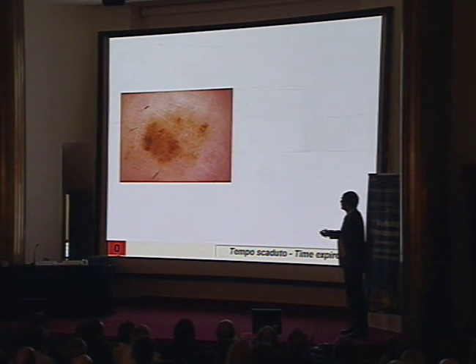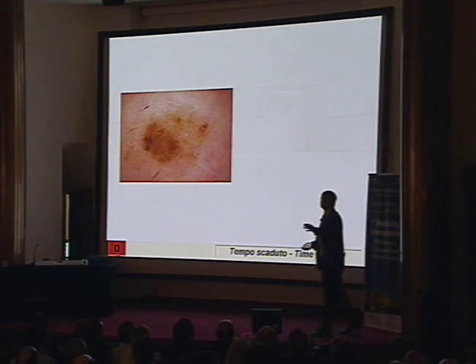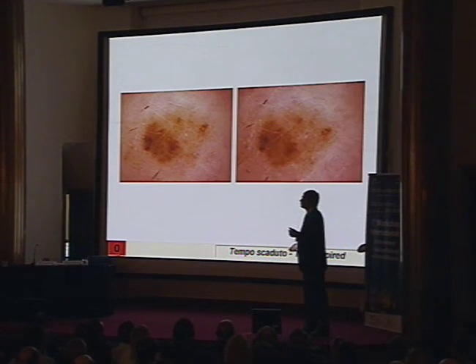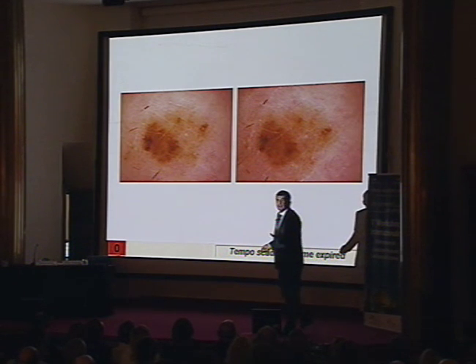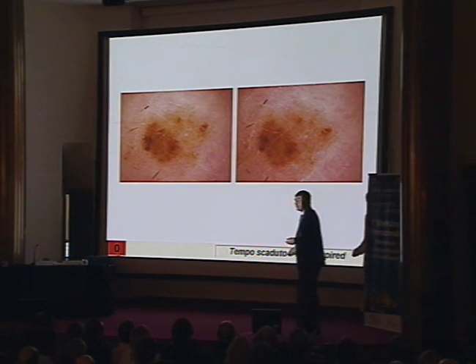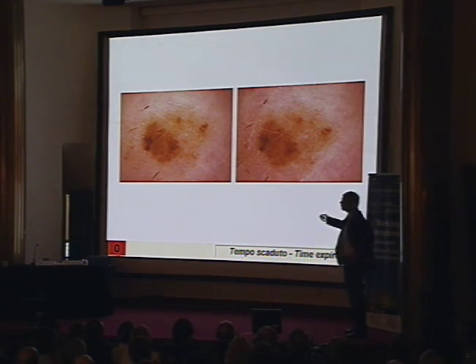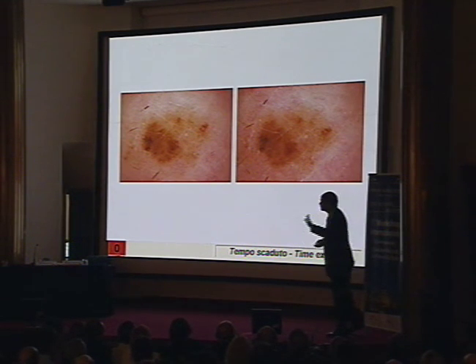Right. This lesion, what do you expect? Change or not? So you think it's a melanoma. Unfortunately, you're wrong. It's not a melanoma. It didn't change, and this is quite a long time, 1 year. So, but eccentric hyperpigmentation, you would monitor this lesion, but then if it's not changing, forget it.